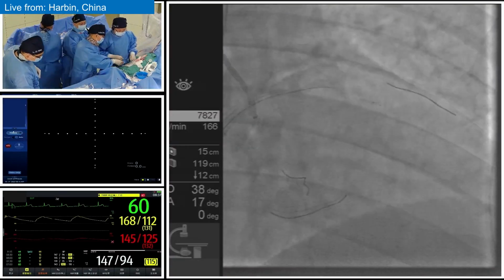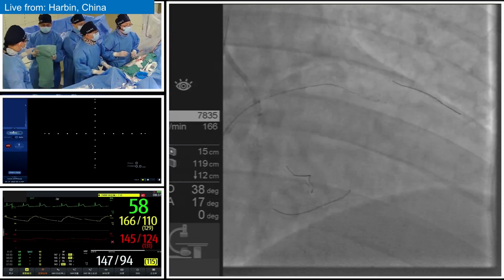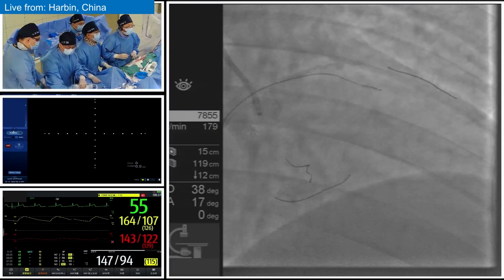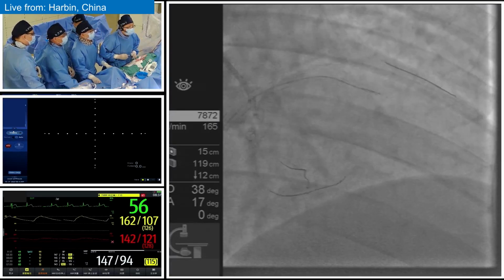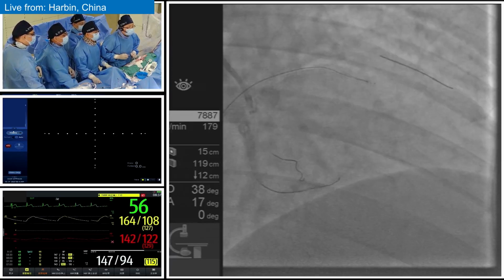And with the CT-RECTOR scoring system, this is a CT-RECTOR 3 to 4 case, which means an extremely difficult CTO case. So I think the antegrade parallel technique doesn't mean a lot in this kind of situation, especially during the second attempt of this case.